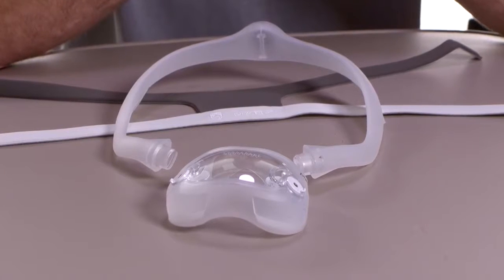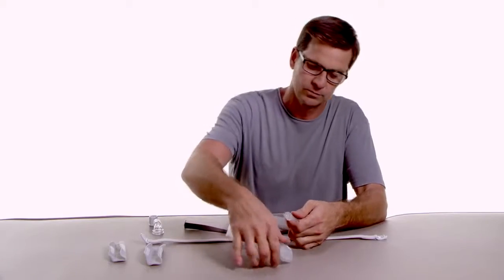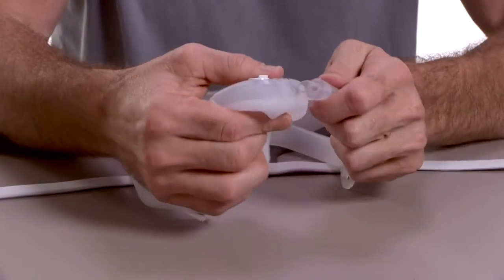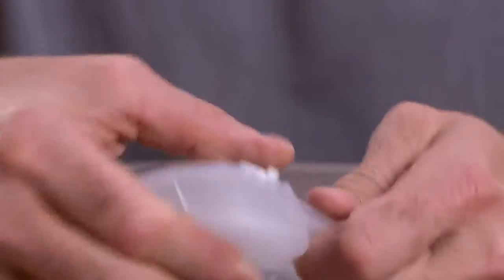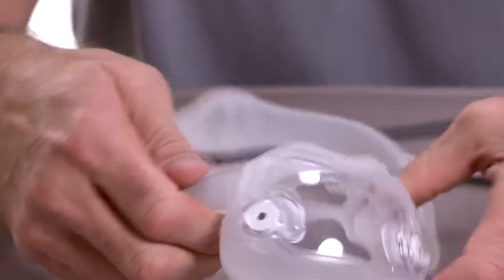To reassemble the Dreamwear mask, insert the mask frame into the cushion. Notice that the openings have a similar shape. Attach the cushion to the mask frame by resting one edge of the frame against the cushion and rolling it into the opening.